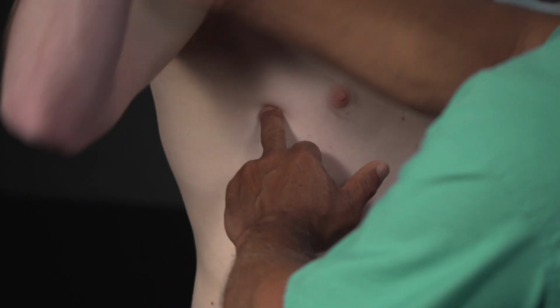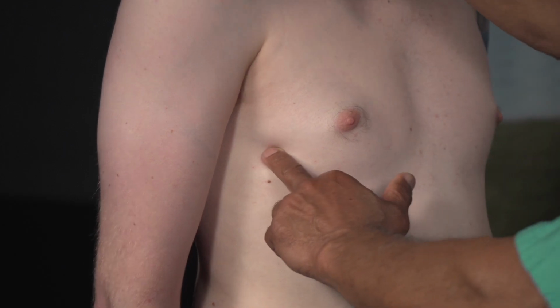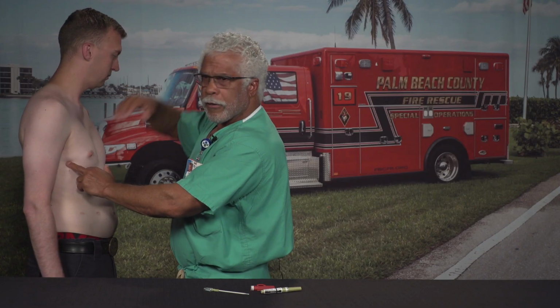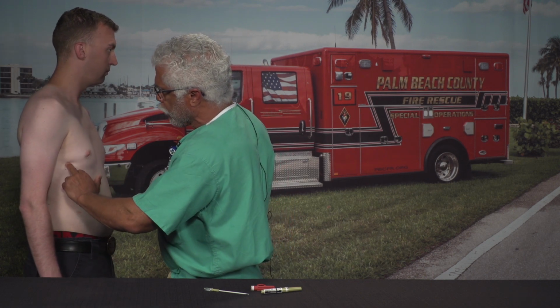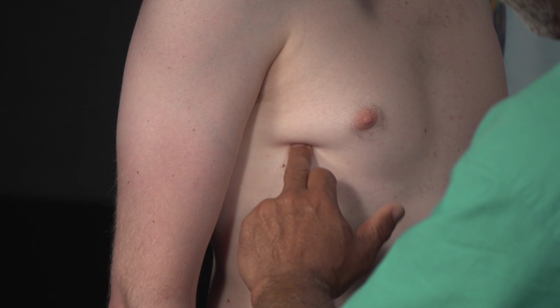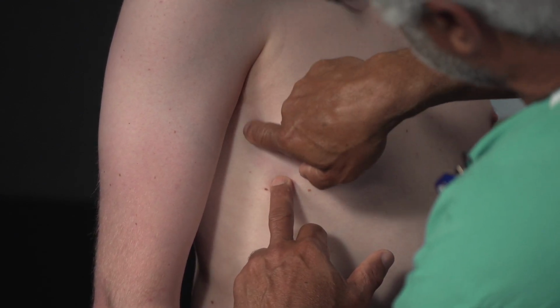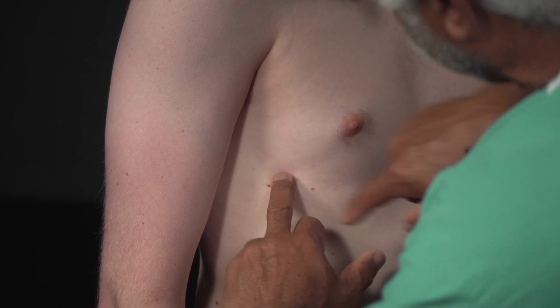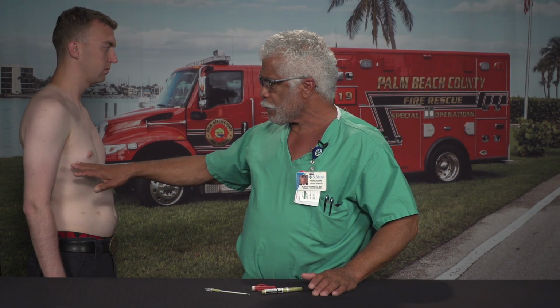Even if he puts his arm down like that, which is anatomical. Let's say he has a shoulder that's busted, the arm is broken. You don't want to be doing this to a patient that has that. It's going to create more pain and more problems. Even in that situation, if you come a little more anterior, here's the anterior axillary line right there. They tell you mid-axillary line, but if you come a little more anterior to that, then you're going to have a much easier time putting the needle. And in fact, for 31 years that I've been putting in chest tubes, that's where I put my chest tubes.